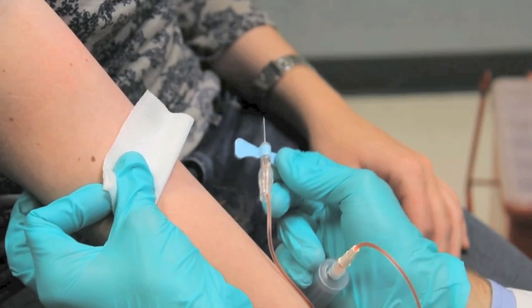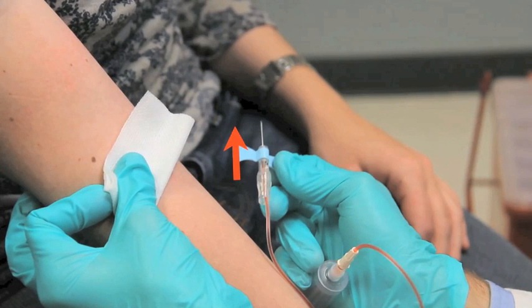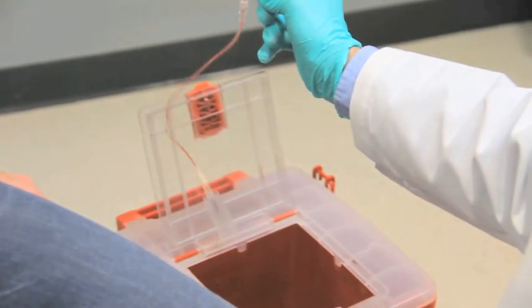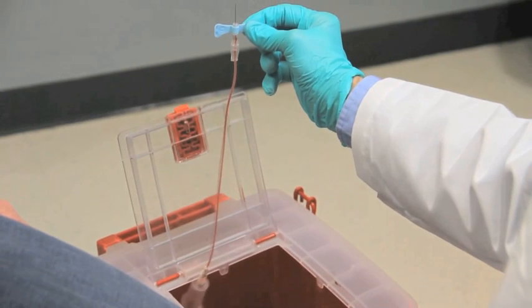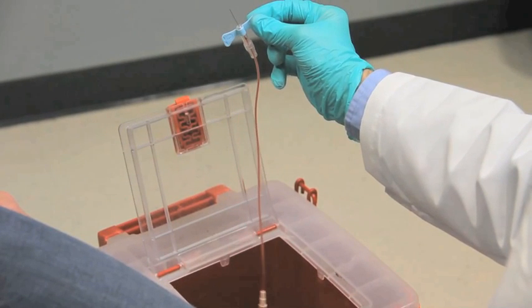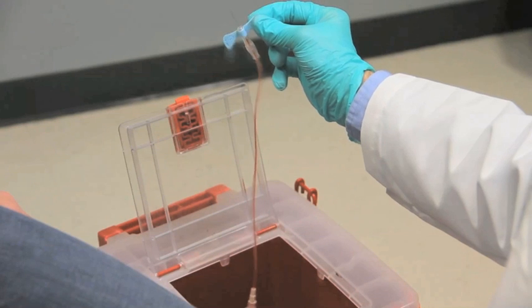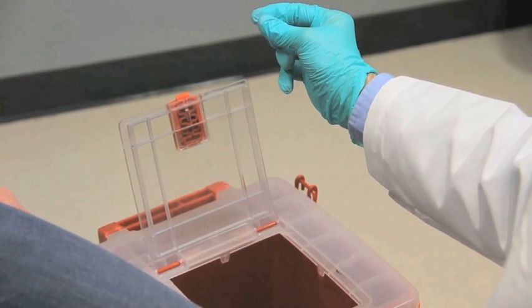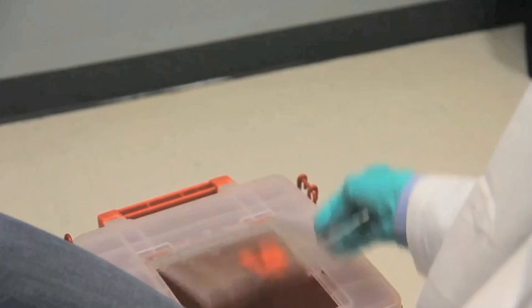Notice that the needle is pointed perpendicularly away from the patient's arm to avoid a needle stick, specifically when reaching for other materials. Simultaneously, either dispose of the needle or activate the needle safety mechanism. To properly dispose the needle, first release the adapter from the right pinky into the sharps container. You should hang down, making the wing pivot in your right thumb and index finger so the needle now points away from you. You can now release the wing, but do not withdraw your right hand suddenly until the wing leaves your fingers, as the wing can stick to your glove during disposal.